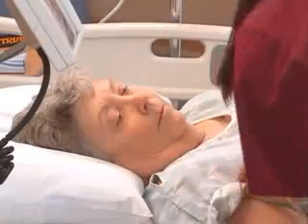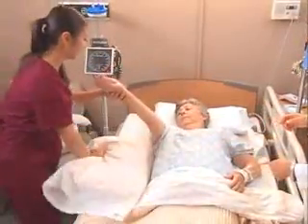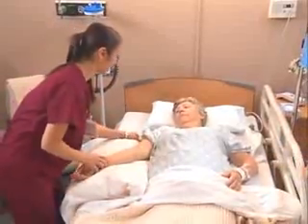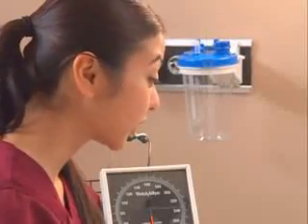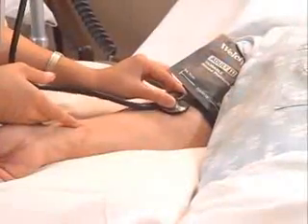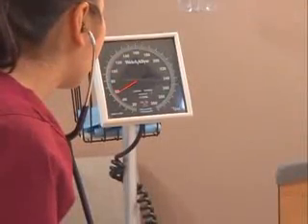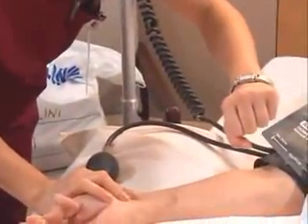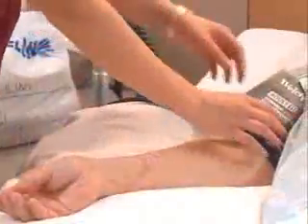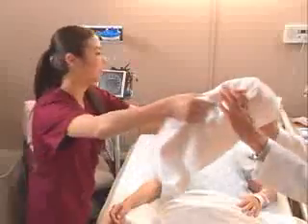Can I get the pillow, please? Thank you. Okay. Now we need to take your blood pressure and pulse. Okay. You can take that, please. Thank you.